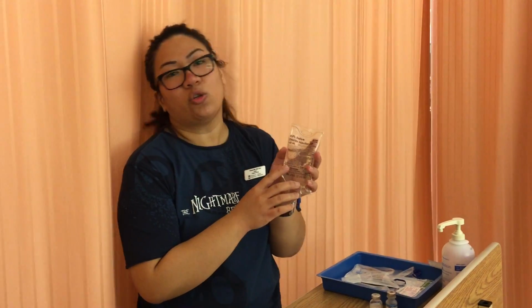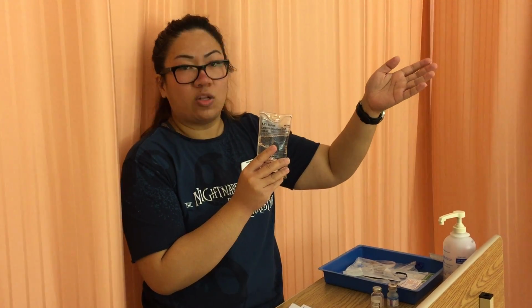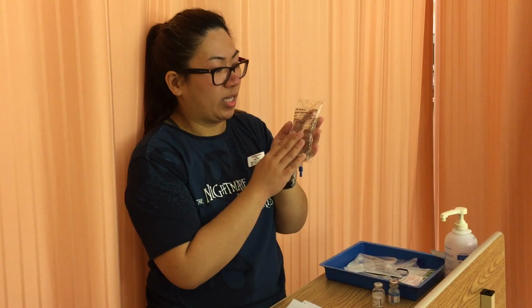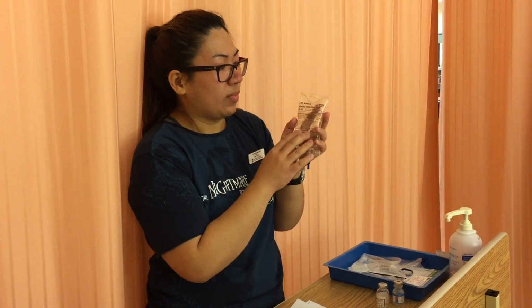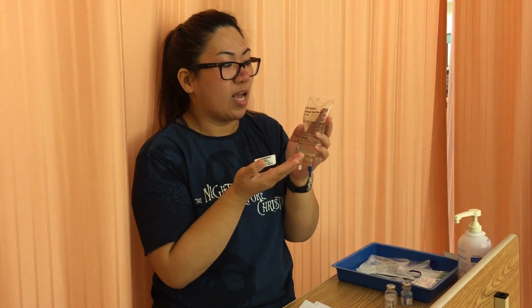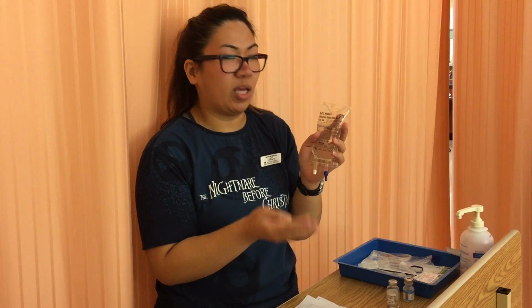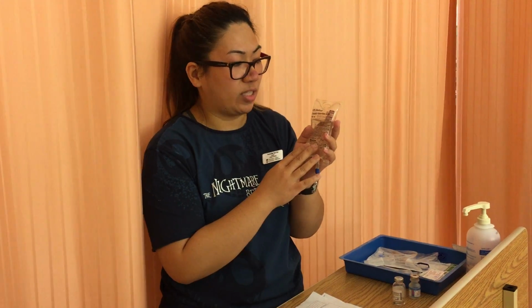What I chose here is a normal saline 100 ml. I chose normal saline because first, the primary that is running is already normal saline, so normal saline is compatible. And also it will replace the losses that the patient had because the patient has nausea and vomiting. I also chose 100 ml to give extra volume for dehydration because the patient also has dehydration.